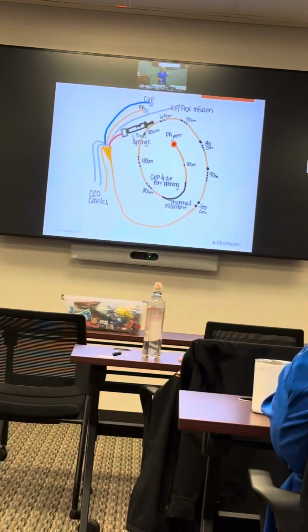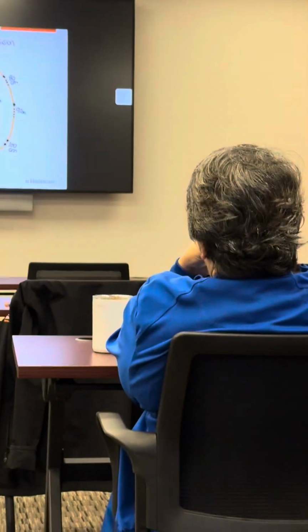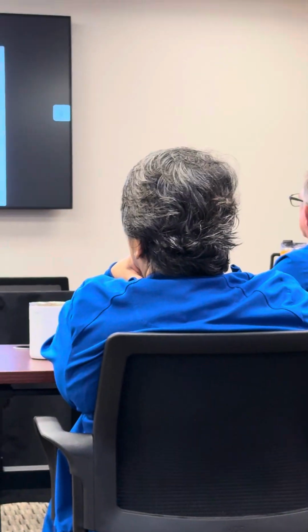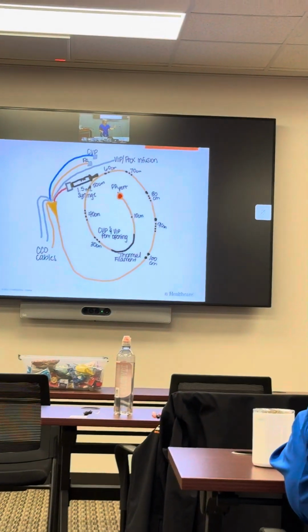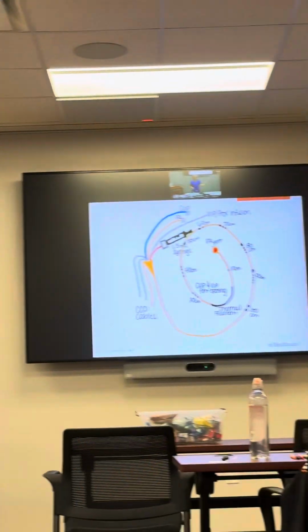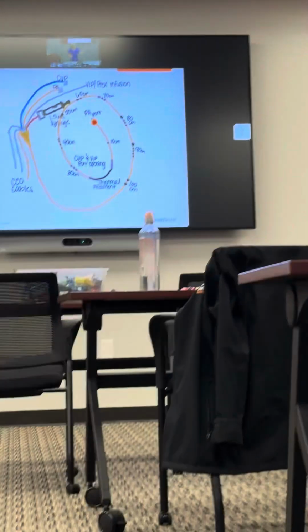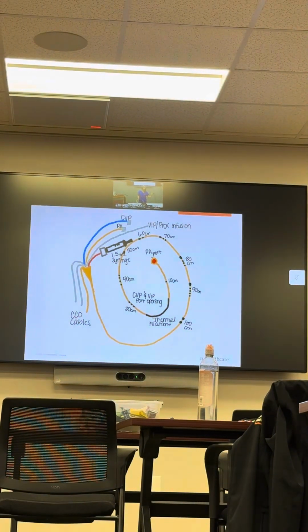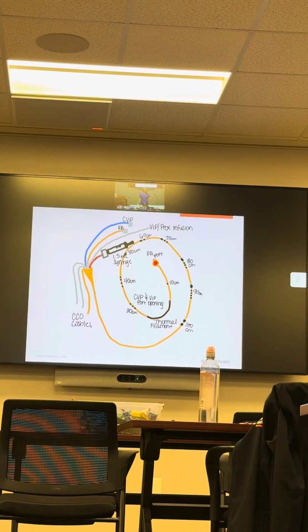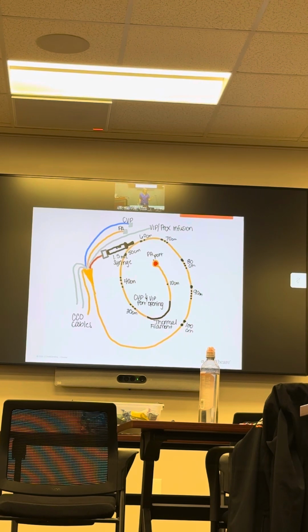But we're in an artery, we're traveling through. This is a blown up balloon that gets stopped on vessel wall. So that's a pulmonary embolism. Would you agree? We only inflate the balloon to wedge it into place and obtain that value, and then it's gone, okay? It stays in that area, but the balloon stays deflated.